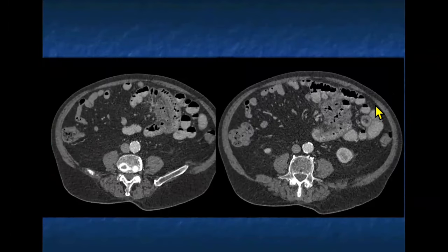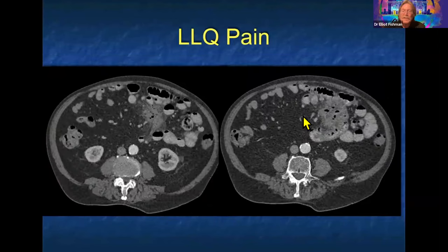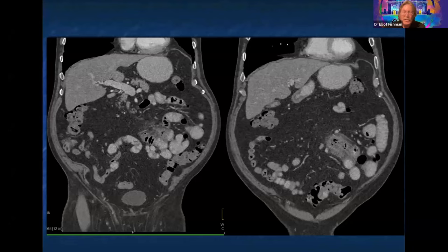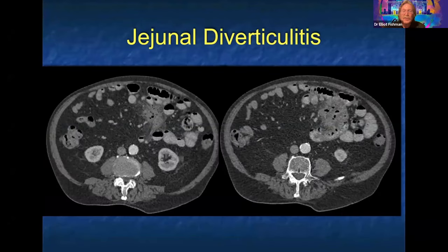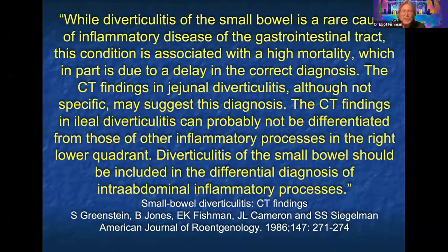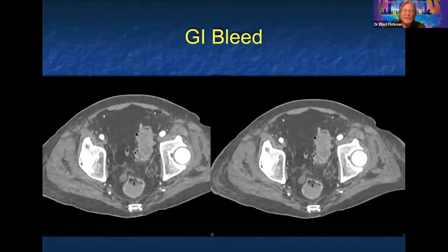Left lower quadrant pain. Answers: carcinoid, diverticulitis, paniculitis. This is coming off the small bowel — it looks like diverticulitis and in fact it is, but it's not your typical colonic diverticulitis. It's small bowel diverticulitis, specifically jejunal diverticulitis, which is far less common and often looks like a perforation. It's pretty rare. I treat it typically conservatively, so it's an important diagnosis to make.